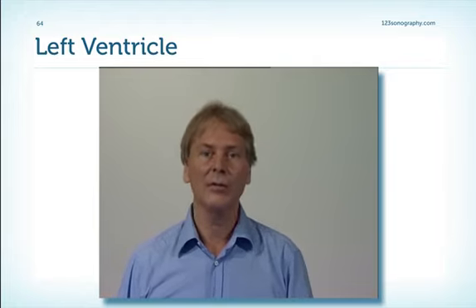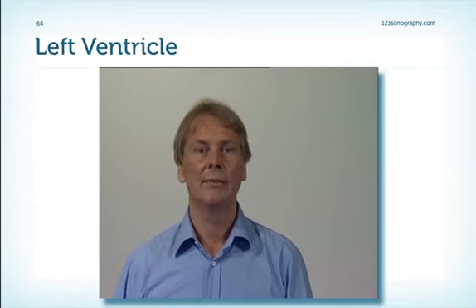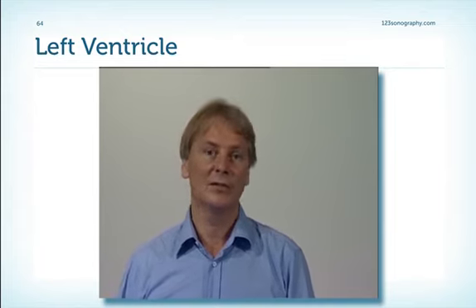So we've seen a number of ways to calculate left ventricular function and to look at the left ventricle. None of them are really ideal, but I believe if you put all these together as the little parts of a puzzle, you can finally arrive at a correct estimation of both size and function of the left ventricle.